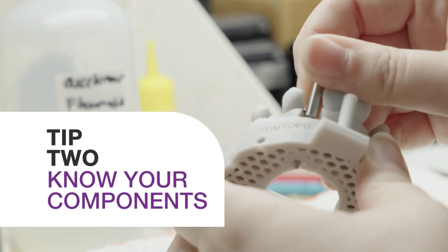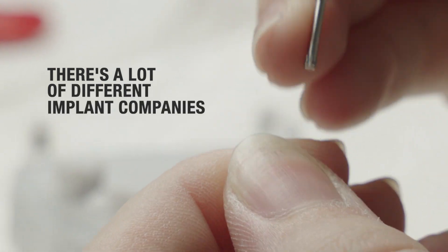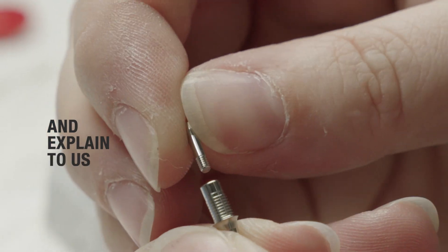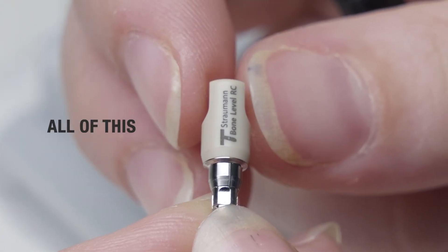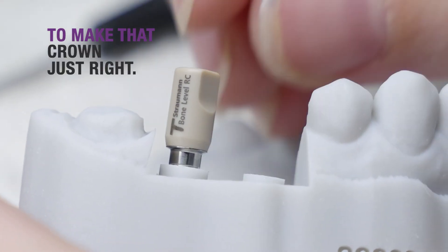Tip number two: know your components. When it comes to implants, they can be a little bit difficult. There are a lot of different implant companies out there, but make sure that you're detailed in your prescription and explain to us exactly what size, what system, what scan body is used. All of this is going to be important to making sure that we have exactly what we need to make that crown just right.